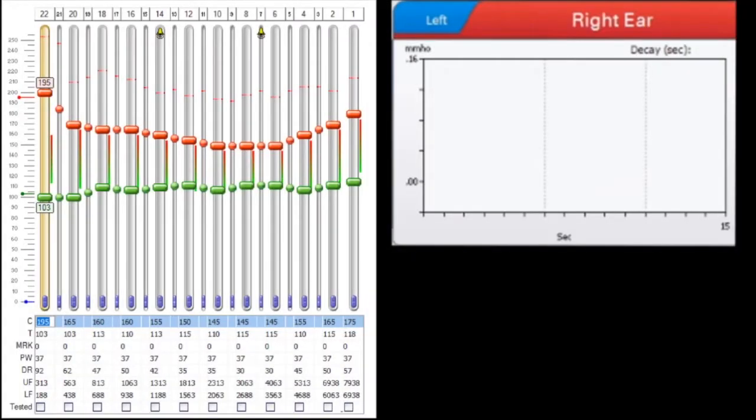In some patients, the ESRT may present as a rising response. Here is an example.